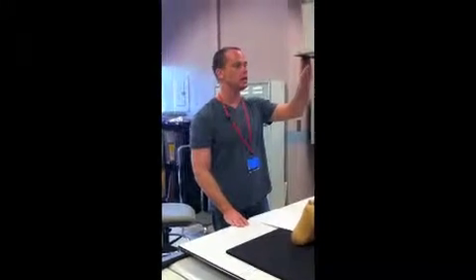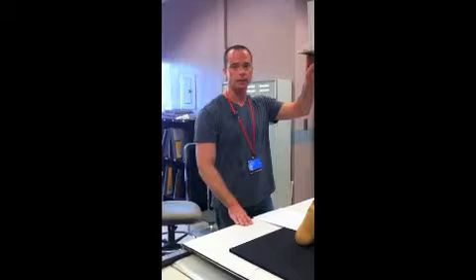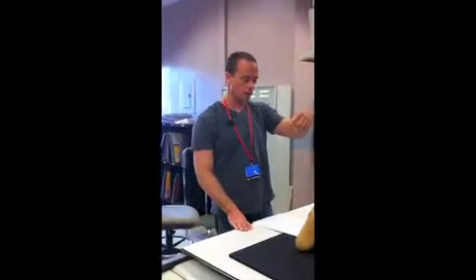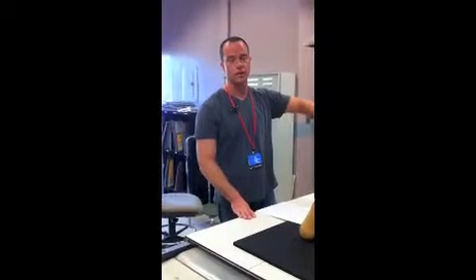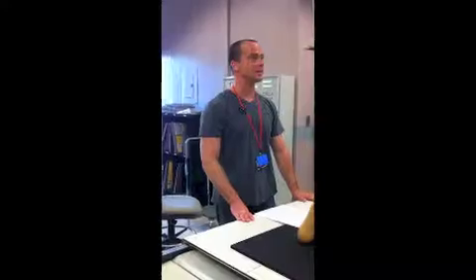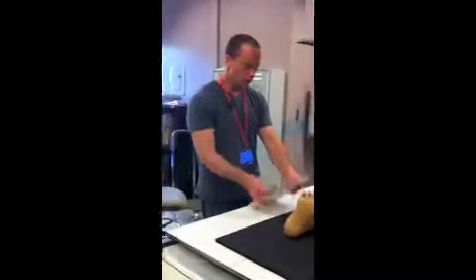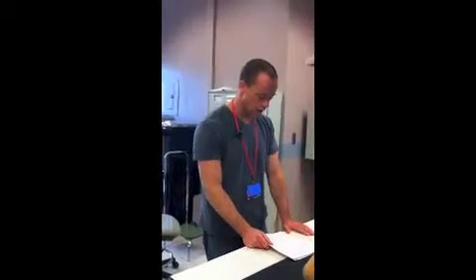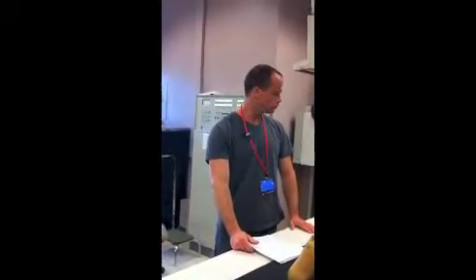AP knee medial oblique is the same as an AP knee. 3 to 5 degrees caudad for a thin patient, 0 for a medium patient, and 3 to 5 cephalic for a thicker patient. Again, we're gonna remain at 0 degree angulation because he is again an average patient. We're gonna keep it at 65 and 5 because we really haven't changed very much, and he's shielded, so it's time to take the exposure.